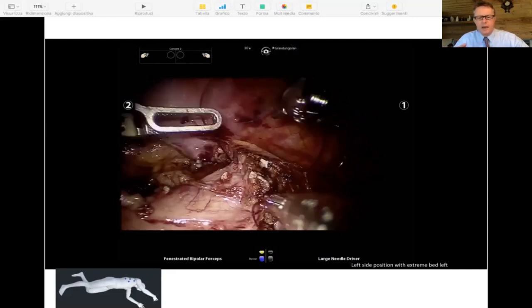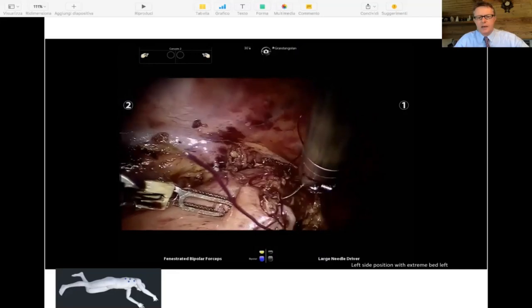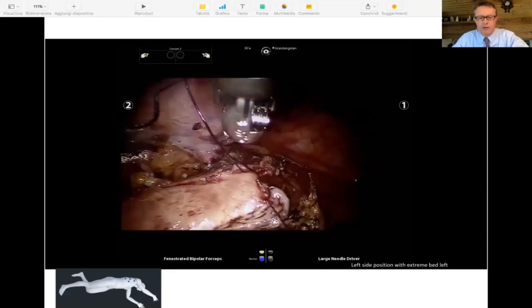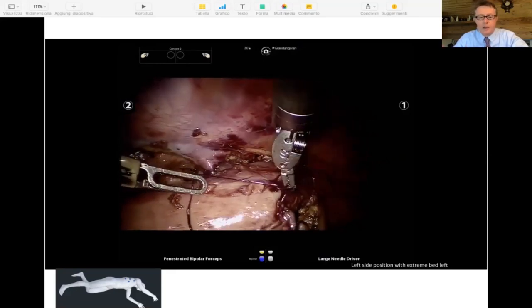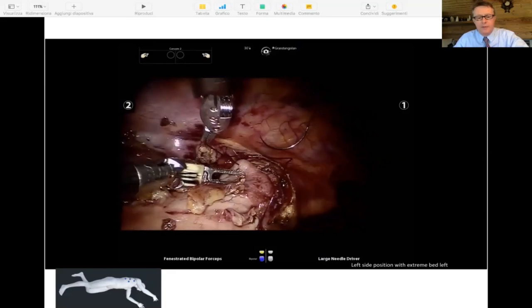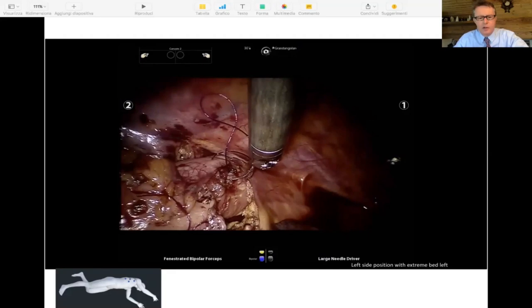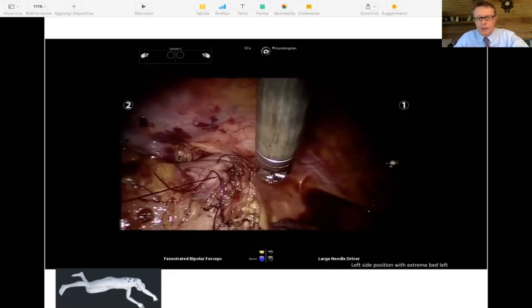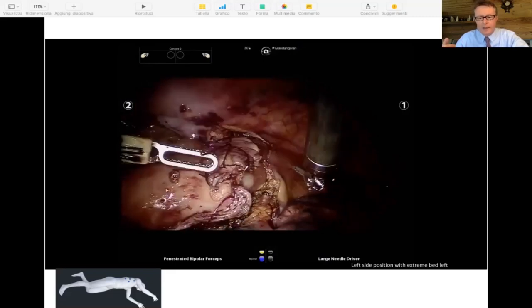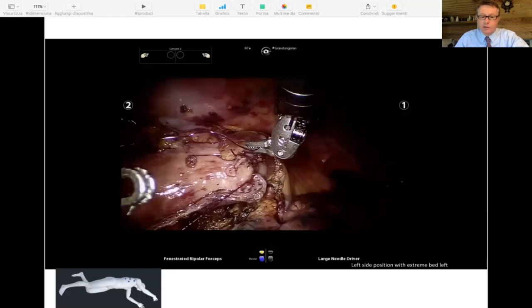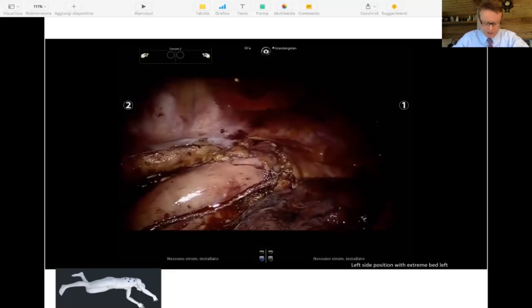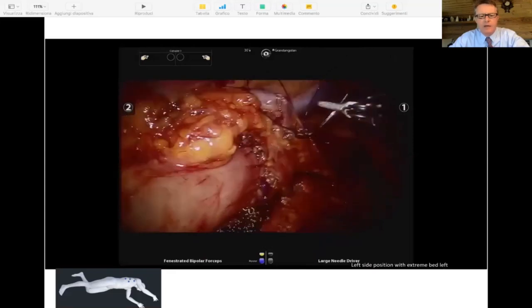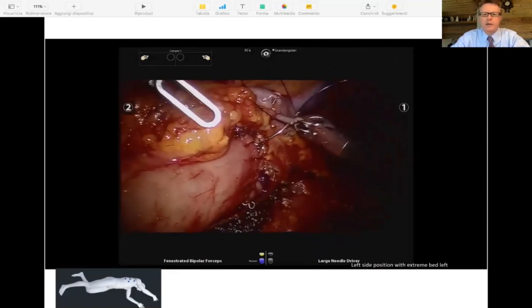Since we have been using this technique, which is about a couple of years now, we have not seen any more anastomotic leaks — which is unusual because in our experience that would range roughly between 10 and 15 percent of cases. So we are very pleased with the new technique. The drainage we place at the end of this procedure is just one — a posterior Jackson-Pratt type drainage advanced transabdominally in the posterior aspect of the esophageal anastomosis, which is usually where a potential leak is likely to happen. We might add some omentoplasty if needed or a pleural patch to reinforce the anastomosis.